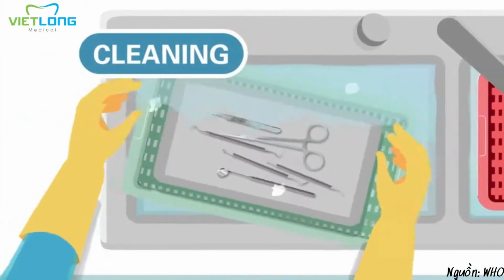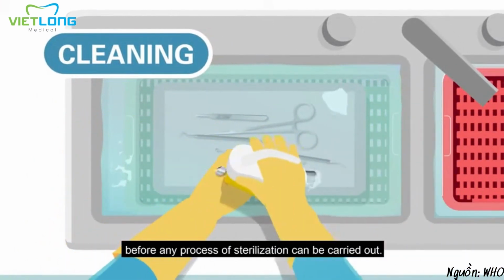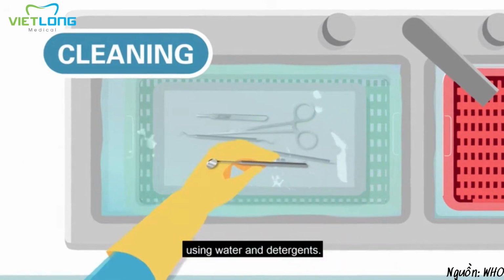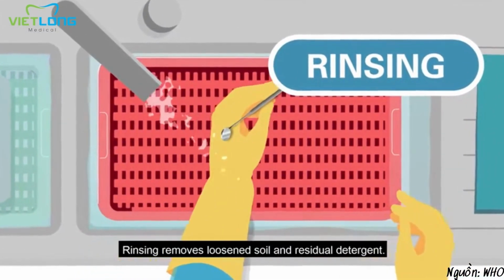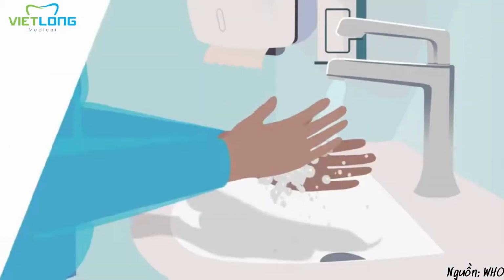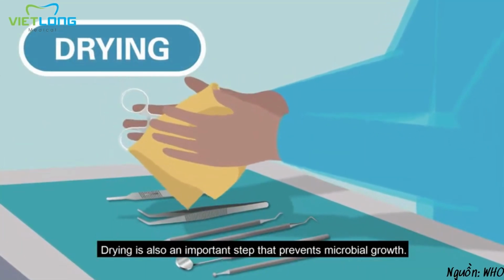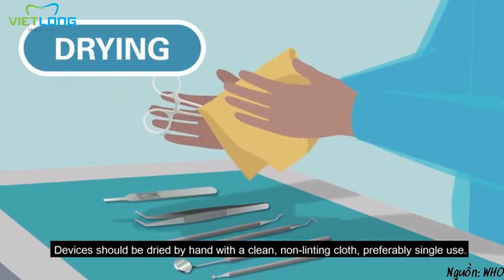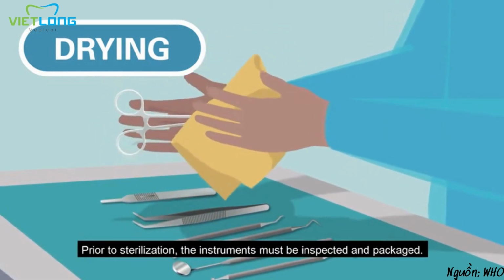Cleaning comes next. This is the most essential step before any process of sterilization can be carried out. Instruments can be cleaned manually or mechanically using water and detergents. Rinsing removes loosened soil and residual detergent. Drying is also an important step that prevents microbial growth. Devices should be dried by hand with a clean, non-linting cloth, preferably single-use. Prior to sterilization, the instruments must be inspected and packaged.